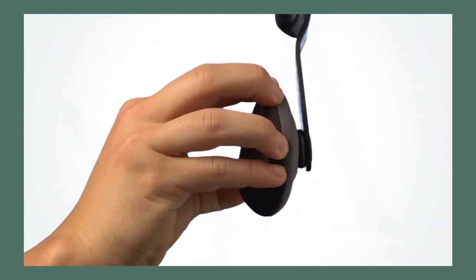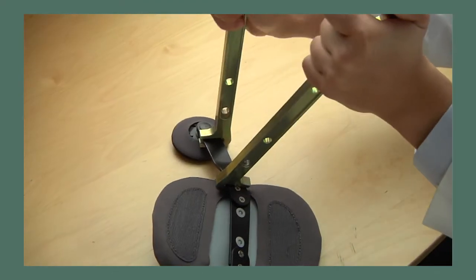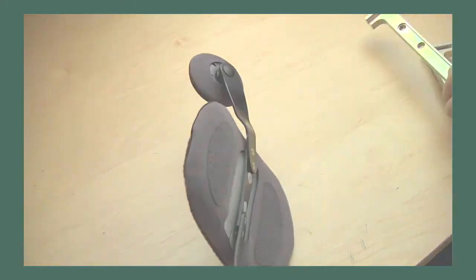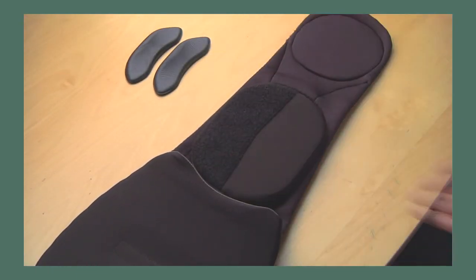The thoracic, trochanter, and chest pads have been designed to automatically adjust to the patient. For certain patients, twisting a strut may be required to achieve a perfect fit. If the patient finds the iliac pads to be uncomfortable, they can be removed entirely.